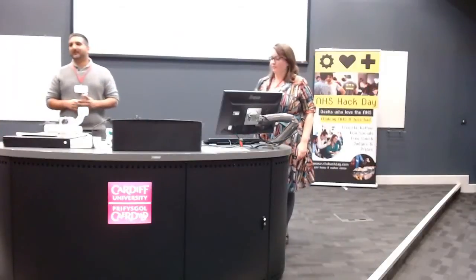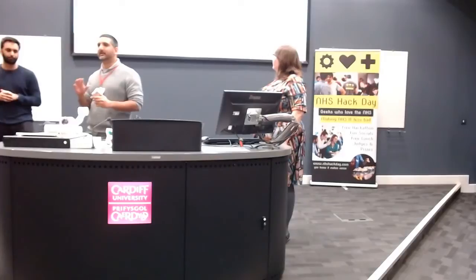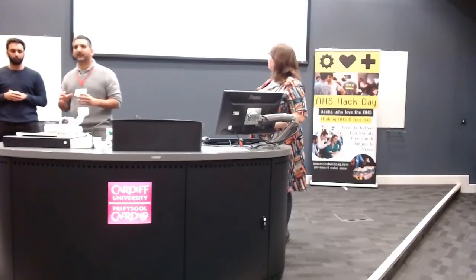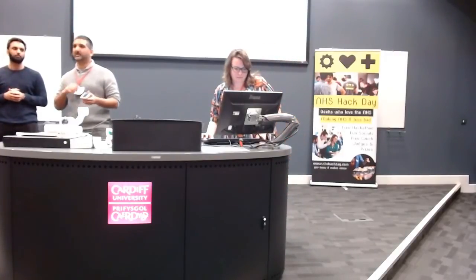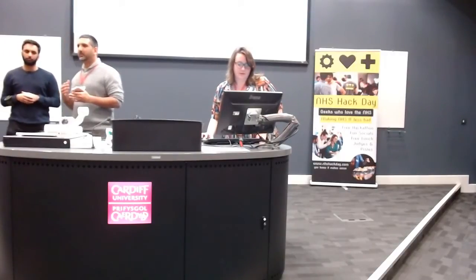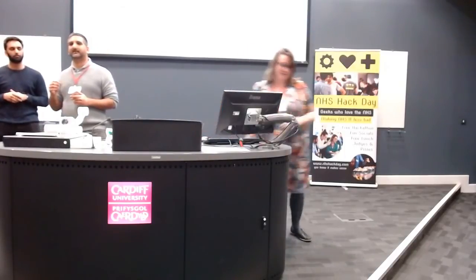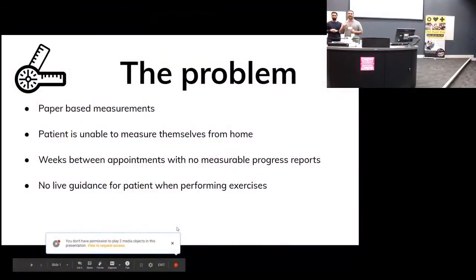Hello. The problem, put very simply, is that at the moment the technology we use in rehab, particularly the goniometer, something to measure joint angles, is only really useful for clinicians for assessment purposes. And we wanted to explore whether we could use that same technology for patients to start taking more charge of their own rehab. So that's the problem we were exploring.